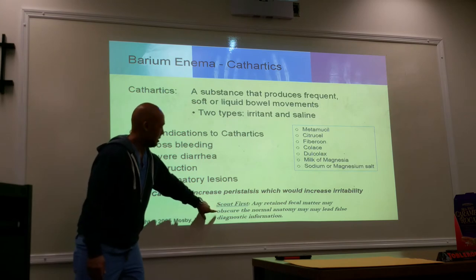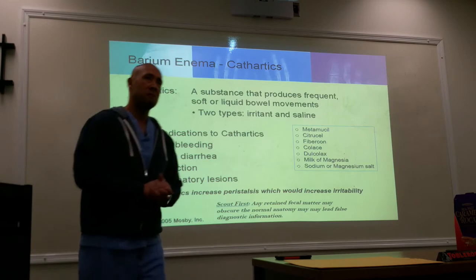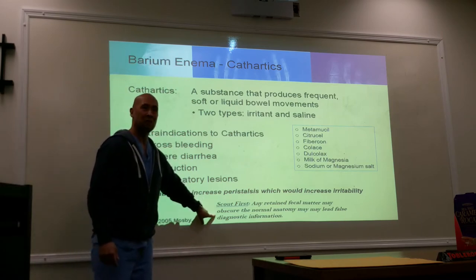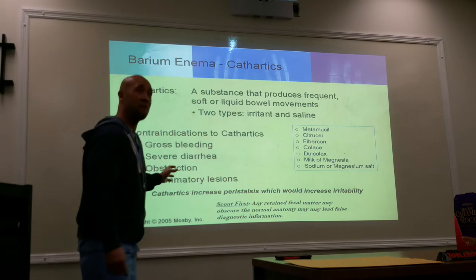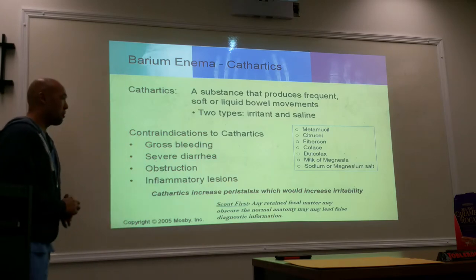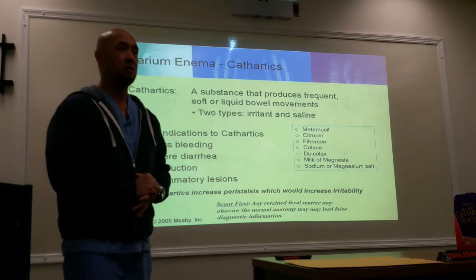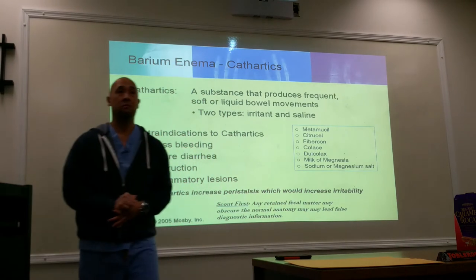This is new. When you're doing a barium enema, just like any of the other fluoroscopic procedures, it's important that you do a scout first. The whole purpose of the scout is to make sure that the patient properly followed the guidelines for preparation. Any retained fecal matter may obscure the normal anatomy and may lead to false diagnostic information. Do we do a regular KUB for this? It's going to be a regular KUB, okay?